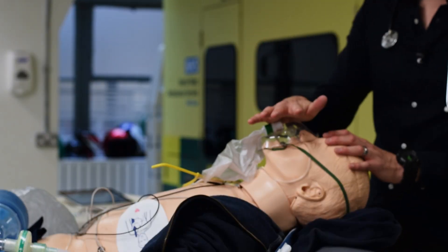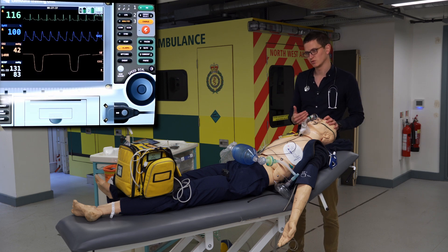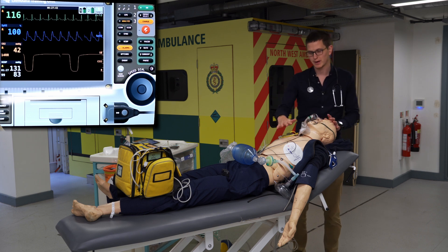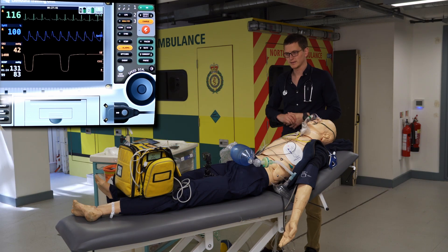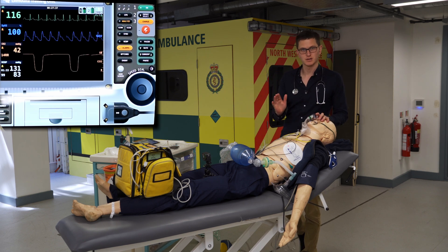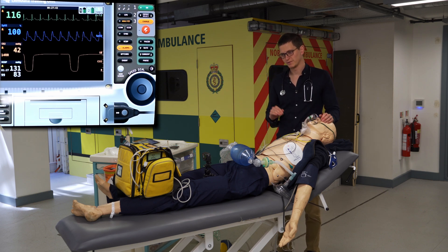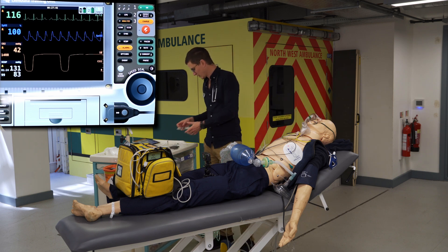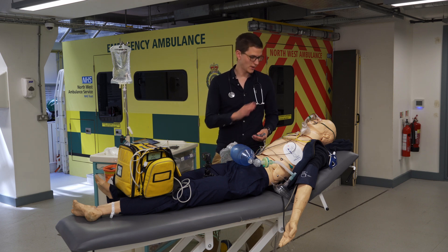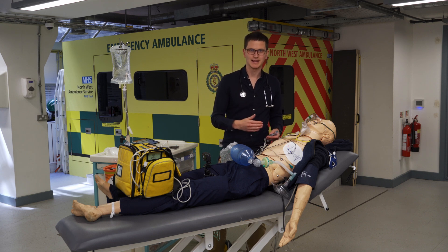We have already pre-oxygenated for three minutes. Heart rate is 116. Saturation is 100%. ETCO2 is 42 and he's breathing at a rate of 12 to 15. We're happy with his ventilation and not concerned about a breathing problem. Are we happy that we have everything ready? Am I ready? Is the patient ready? Is the equipment ready? Being prepared is the key to this process.